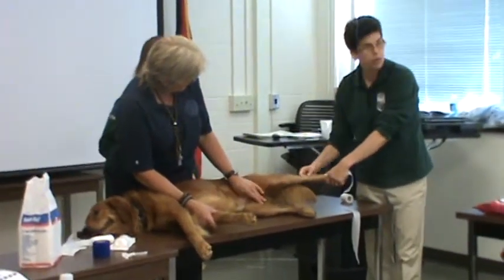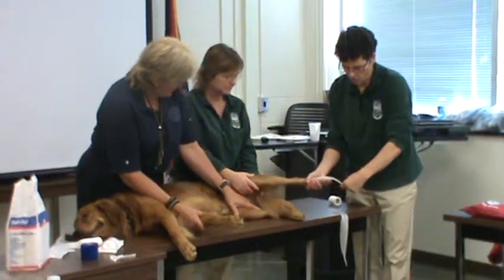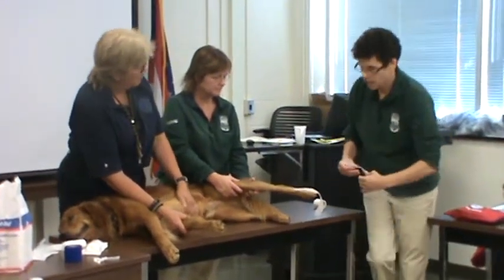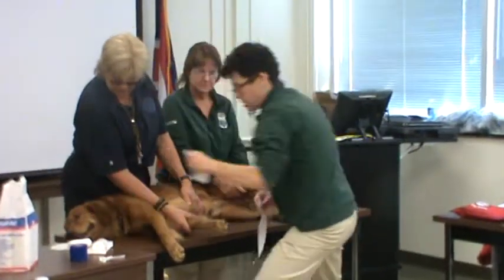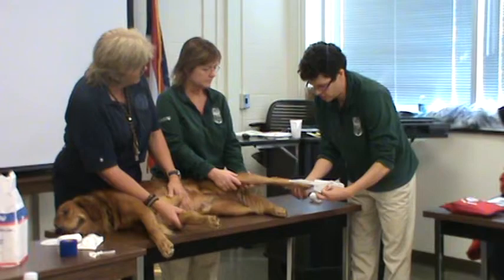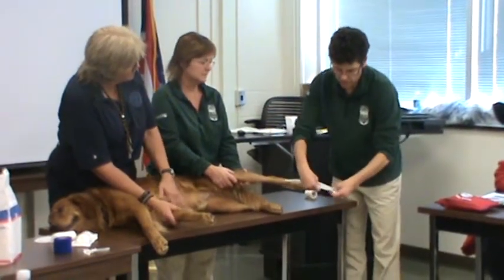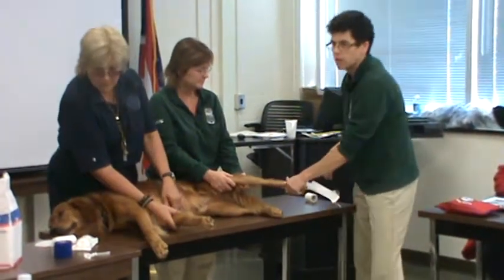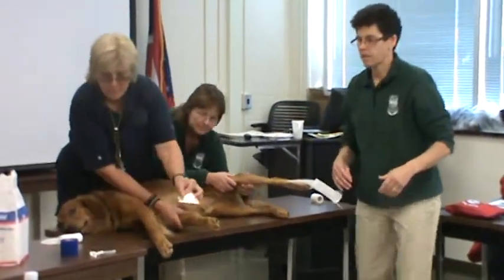We have a wound here over the hock and we're going to put on these taped stirrups. I'm going to take a little piece of something to keep my tape from sticking to itself. A tongue depressor works really well but I don't have a tongue depressor. So how's my three inch stuff coming along?